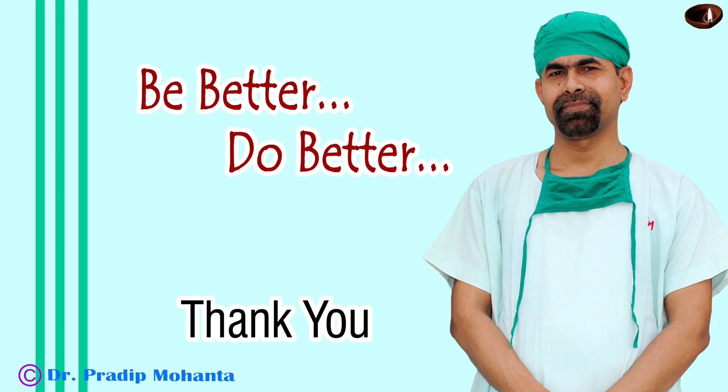Thank you very much for your attention. Hope this video will help you in developing your surgical skills. Just be careful to protect the posterior capsule in vitrectomized eyes, because if there is a rent, a piece will immediately drop and settle on the macula. You can employ the technique that I have shown: for the last two pieces of the nucleus, peel off the epinuclear shell and use the epinuclear shell as a contact lens to protect the posterior capsule.